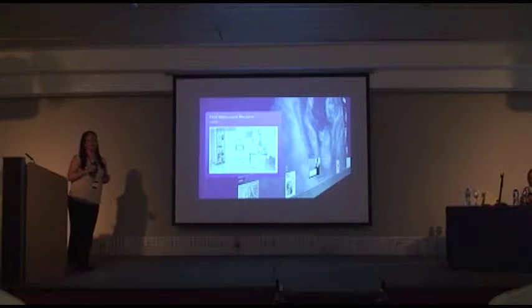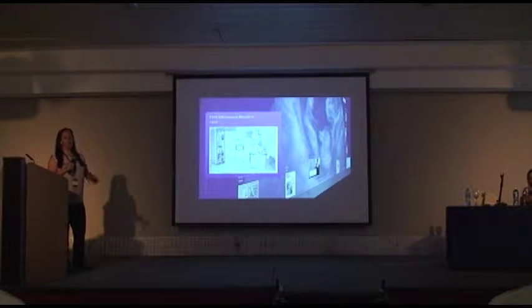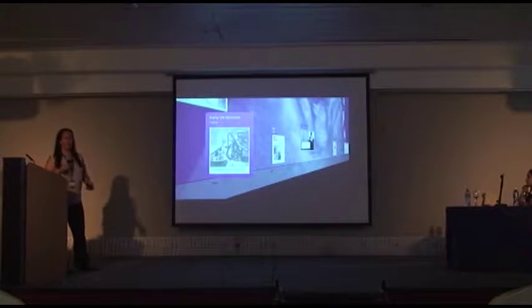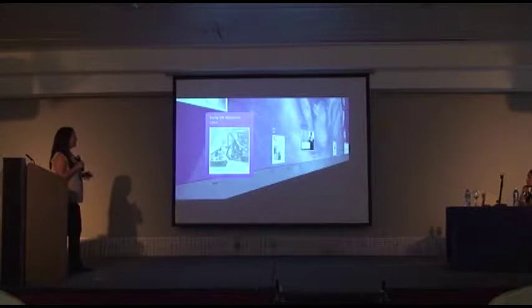So I always like to begin my discussions with a history of ultrasound because everyone is always surprised. They think that we've always had these really small machines. The first ultrasound machine in 1950 was so large that it needed its own room, a large room at that. And the early ultrasound machine in 1954 required that a patient be in a water bath. Not so useful in the emergency department, I would say.